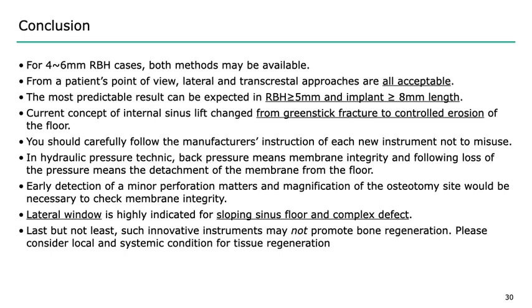Current concept of internal sinus lift, transcrestal approach, changes from green stick fracture of the floor to controlled erosion of the floor. You should carefully follow the manufacturer's instruction of each newly developed instrument not to misuse. So there are so many different types of instrument in the market. So you would need to master some instruction and some specification of each instrument.